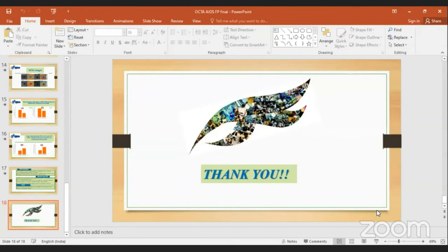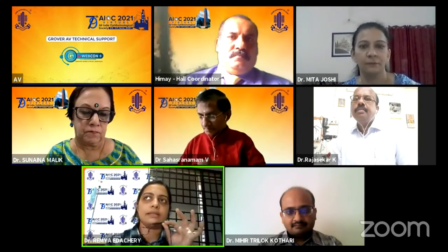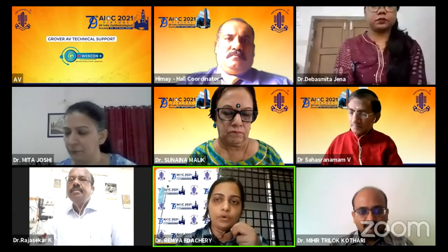Do we have any questions for the presenter, please? I have just one thing to ask Dr. Remya. This is an interesting study, but tell me how useful would it be in day-to-day practice for strabismologists or those who are treating amblyopia? Yes, ma'am. OCTA is a non-invasive technique. If we do OCTA and see that the deep capillary plexus vessel density is more, we can tell the parents that this child has more chance of getting amblyopia improved compared to children with a low vessel density.